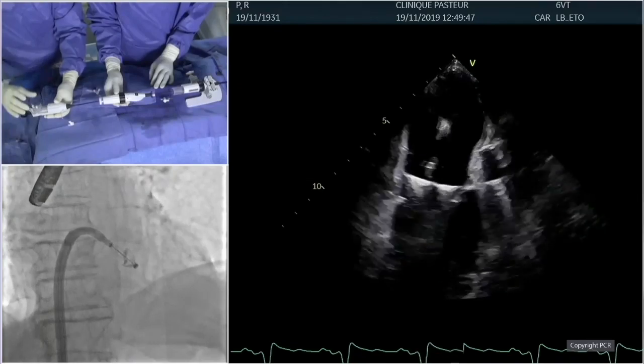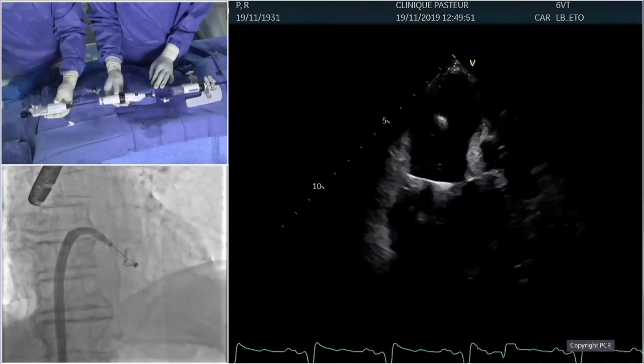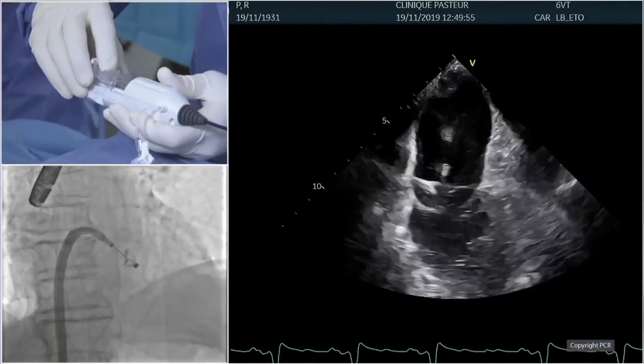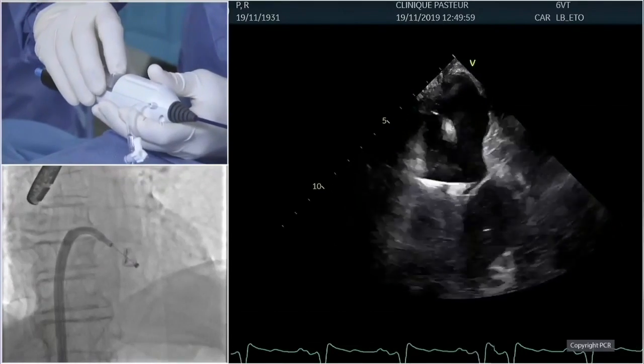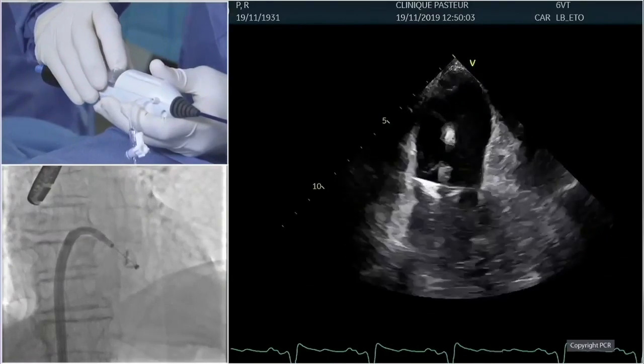So I'm going to descend both clasps at the same time first. Pull on that again in order to assess that. I'm currently doing that by pushing the sliders. We saw both clasps coming down. Okay. Up. So we perfectly see the posterior one and the anterior.